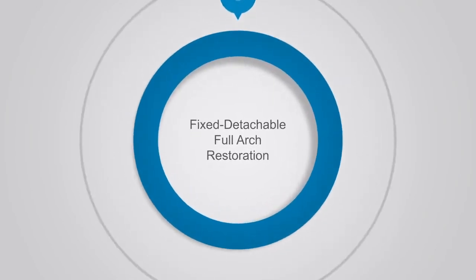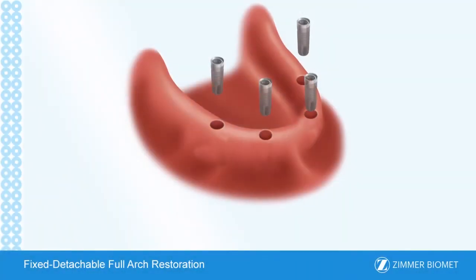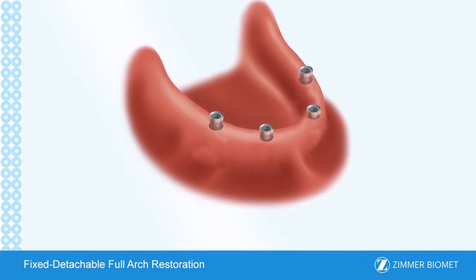Fixed-Detachable Full Arch Restoration. A fixed-detachable full arch restoration is used when all teeth are missing in the upper or lower jaw. This is an alternative treatment to the traditional full denture or implant overdenture, which rests on top of the gum tissue. In this procedure, multiple implants are placed. The implants are typically left to heal for a few months. Exact time will depend on the quality of the bone where the implant is placed.